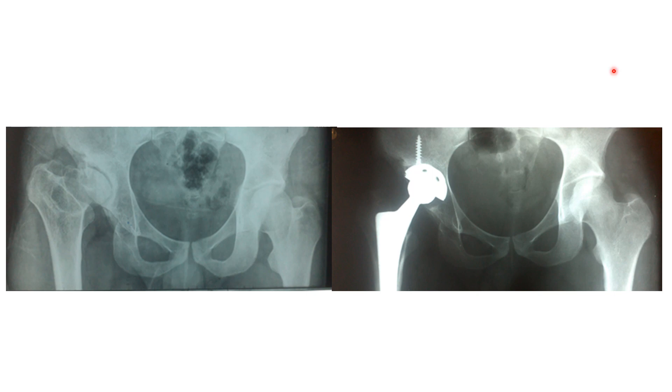To sum up: with acetabular dysplasia, where you have shortening, a shallow acetabulum, and a high hip center, you have to think of trying to make your acetabular reaming in a better anatomic position — bring it down and try to have good cover for the weight-bearing area of the component you are going to insert. Regarding the shortening of the femur, you have to do a proper release of the muscles controlling the hip — mainly the abductors, the iliopsoas, and the adductors. Thank you very much for watching.